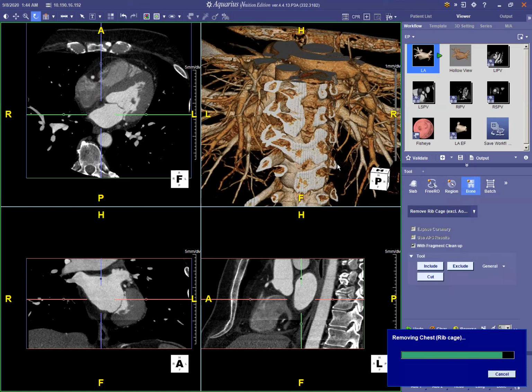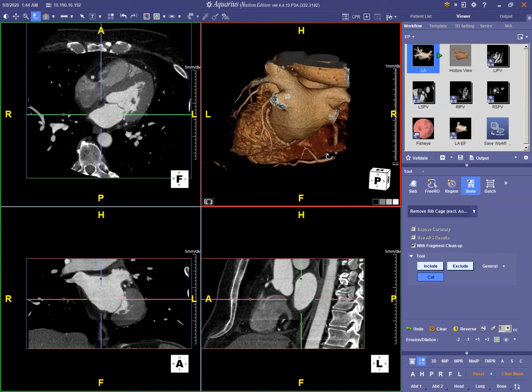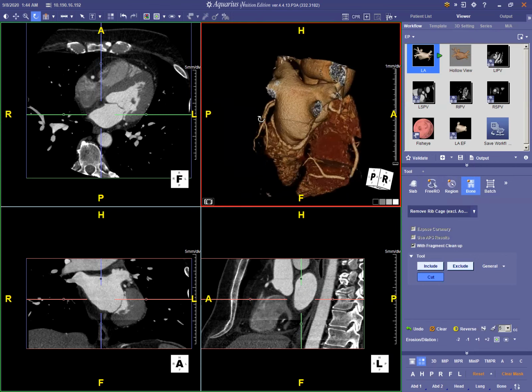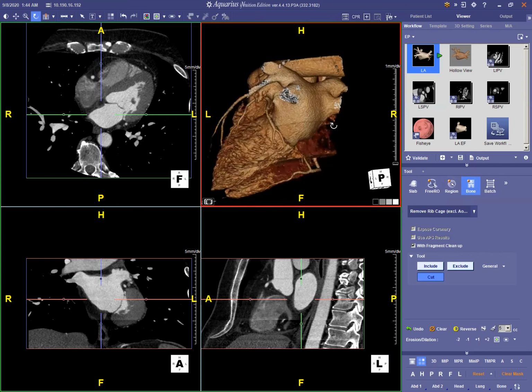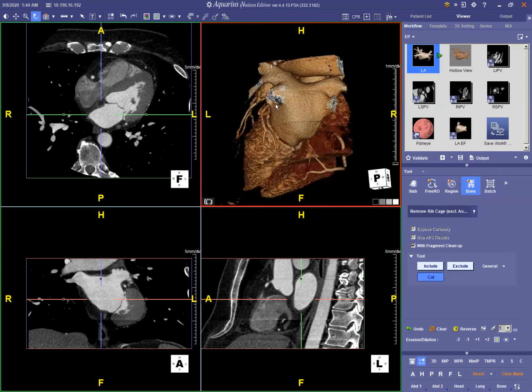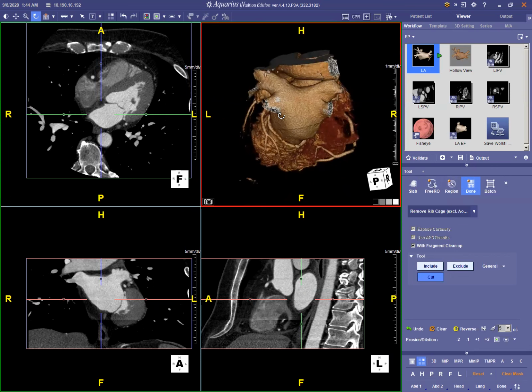volume. That's pretty good. So it's up to you how clean you want things to be, but to me it's reasonable as far as visualizing the pulmonary vein anatomy, and it looks pretty conventional, 2 on each side. I'll just do some captures.